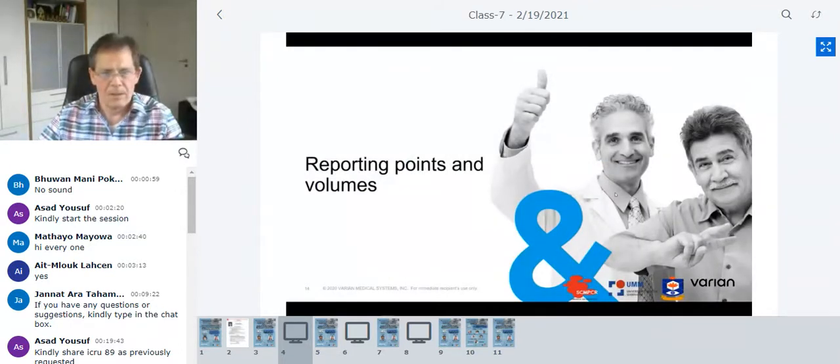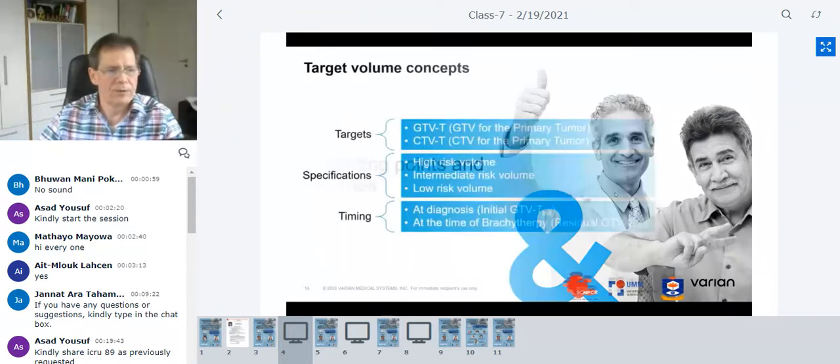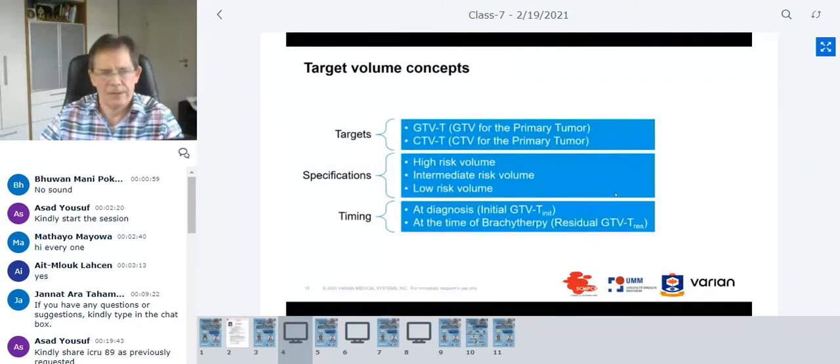Okay, some information about reporting points and volumes. This comes also mainly from the ICRU report 89.